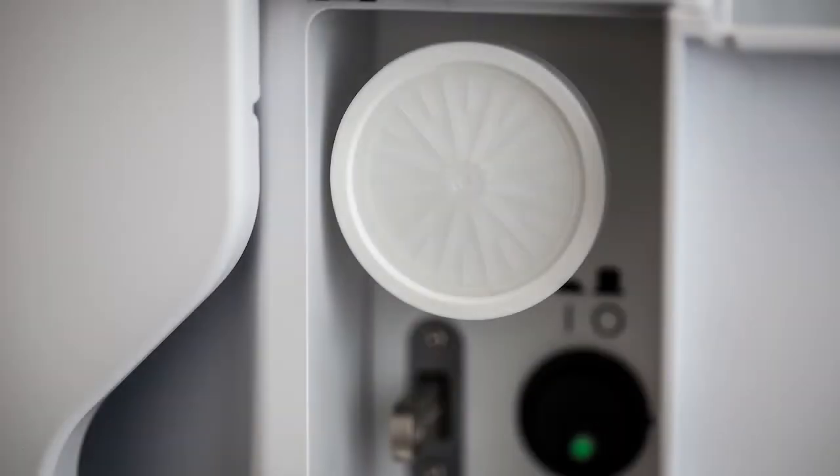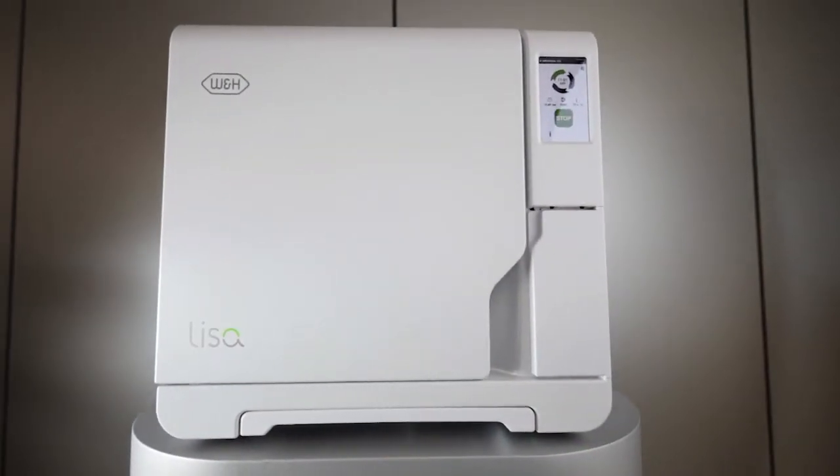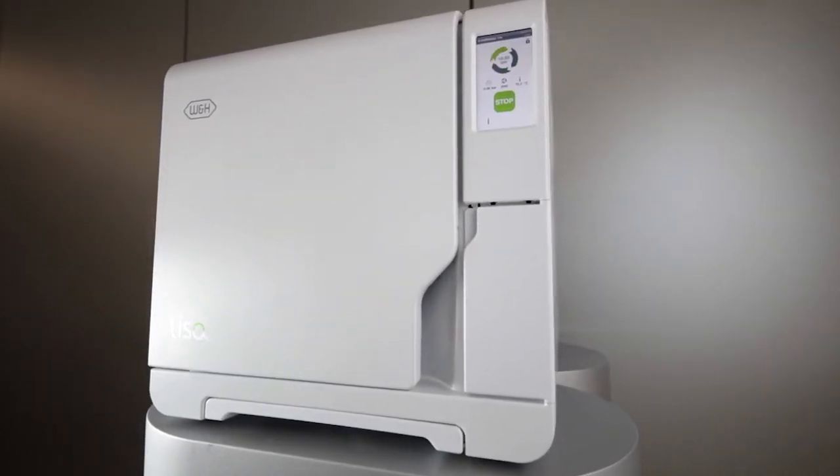The bacteriological filter is an integral part of your W&H Lisa sterilizer. It filters the air that enters the chamber when the batch is being dried and ensures that the air does not get contaminated again.